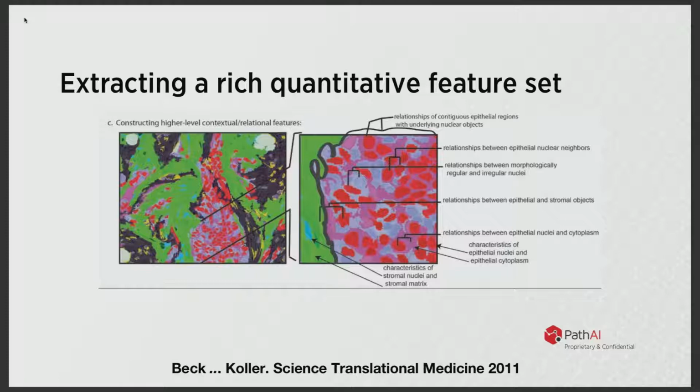And there's a few basic things you'd want to train the computer to do, which is, for example, identify where's the cancer, where's the stroma, where are the cancer cells, where are the fibroblasts, et cetera. And then once you train a machine learning-based system to identify those things, you can then extract lots of quantitative phenotypes out of the images. And this is all using human-engineered features to measure all of the different characteristics of what's going on in an image. And machine learning is being used here to create those features. And then we use other regression-based methods to associate these features with things like clinical outcome.